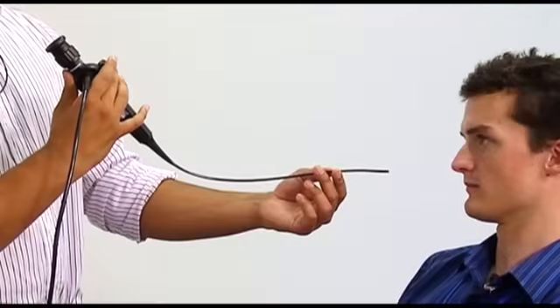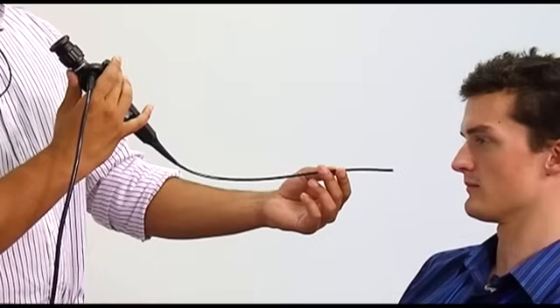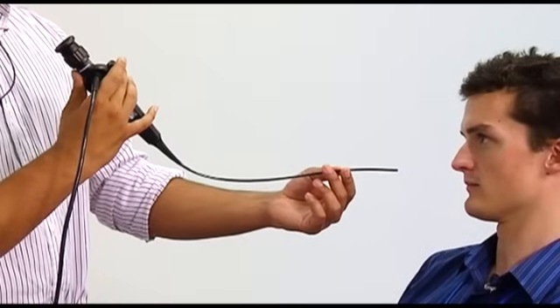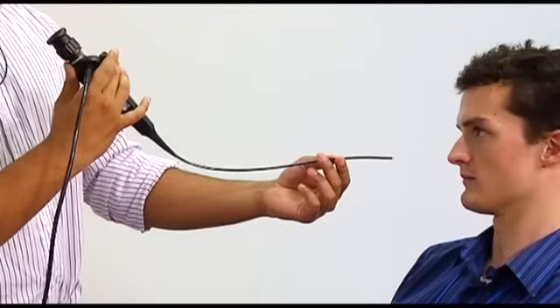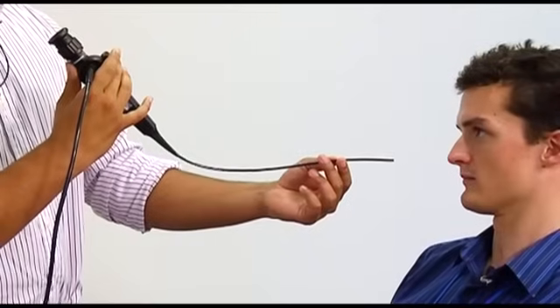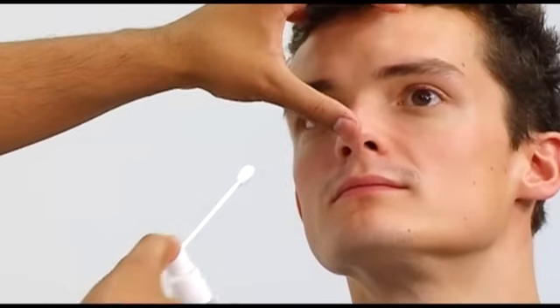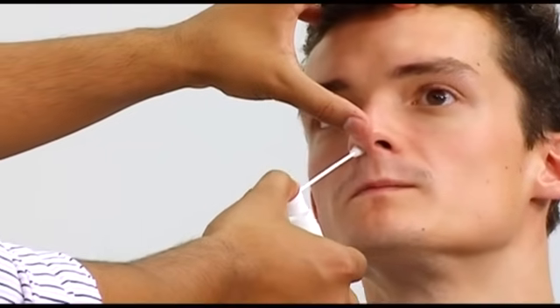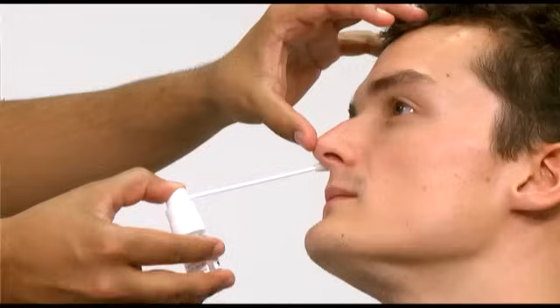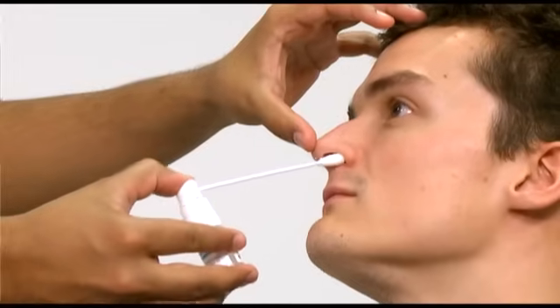A routine part of the ENT examination is the use of a flexible nasoendoscope to look at the internal aspect of the nose, the post-nasal space, and even as far back as the larynx. Before nasoendoscopy can take place, the nose must be anaesthetised with local anaesthetic spray in each nostril. This will take a few minutes to have an effect.